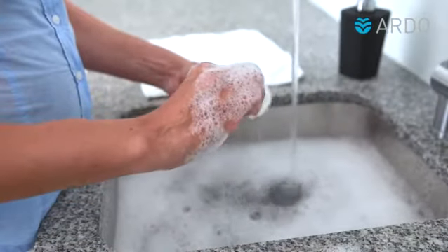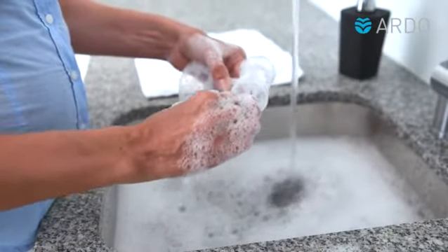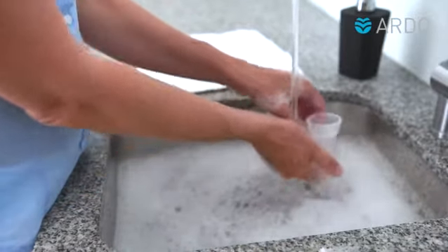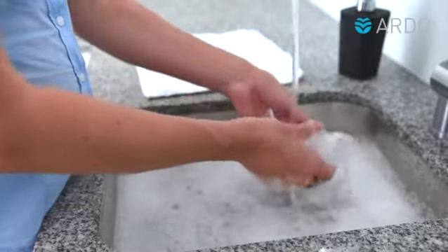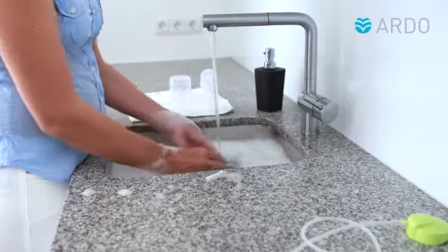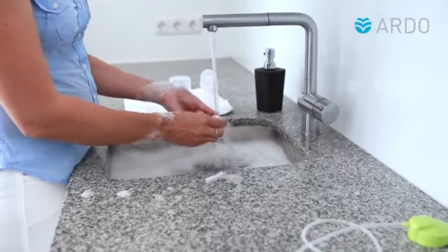Then wash the parts with warm drinking water and regular dishwashing liquid. Rinse the parts until the water is completely clear and then let them air dry or use a clean cloth to dry them. You can also wash the individual parts in a dishwasher. Please always make sure the pump set is clean and dry before putting it away.